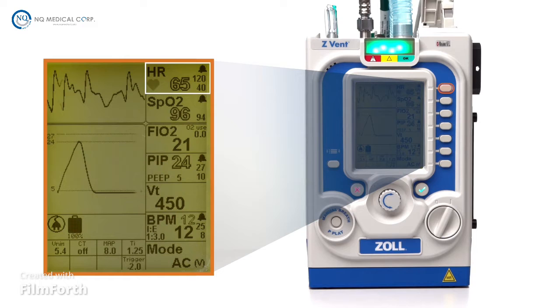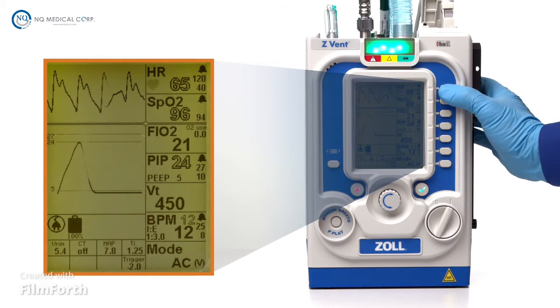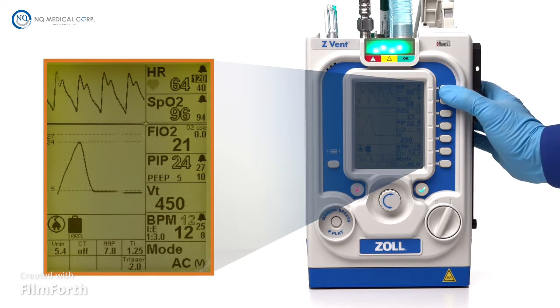The first parameter window is the patient's heart rate. The outlined text represents the patient's current measured heart rate. High and low alarm defaults are 120 and 40 beats per minute. Press the parameter button once to change the high heart rate and twice to change the low heart rate.